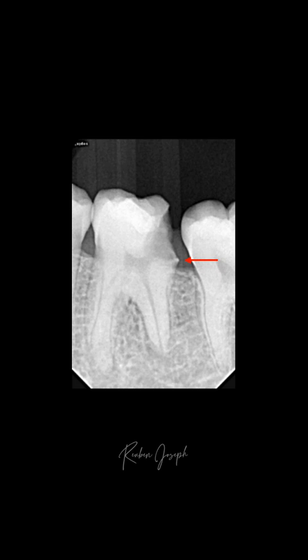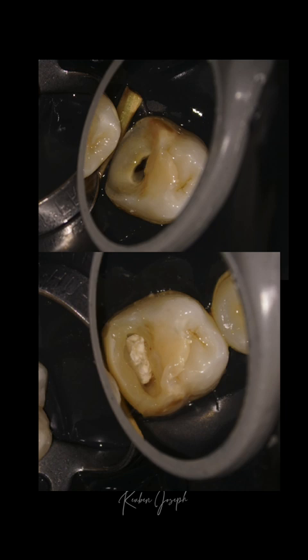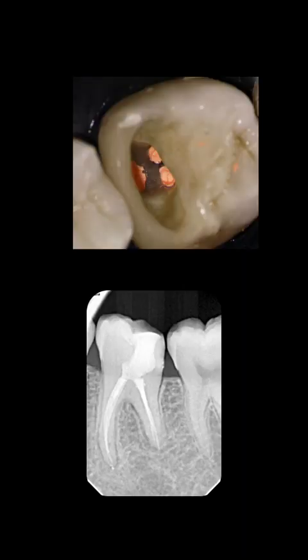This is another case of a lower molar where I have a deep margin on the distal surface. Everything that was discussed in the previous case has been done here: gingivectomy, a rubber dam placed, and in addition to that, I've also passed a wedge in between. The caries removal has been complete, and what additionally I have done in this case is build up the proximal wall, a pre-endo build-up which wasn't done in the previous case, where I banked entirely on the rubber dam inversion below the margin of the tooth. And that's the same case obturated with the post-endodontic restoration.